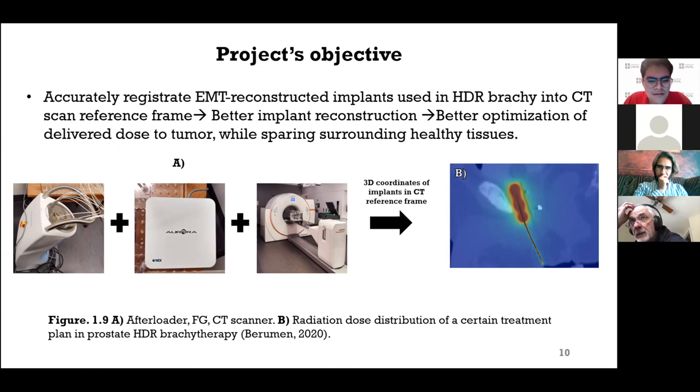And now you're exploring a prototype. Yeah, it's a prototype with a phantom, but the ultimate goal is to actually take it to the clinics, perform a clinical study. Is this going to be part of your master's thesis, or is it left to someone else?